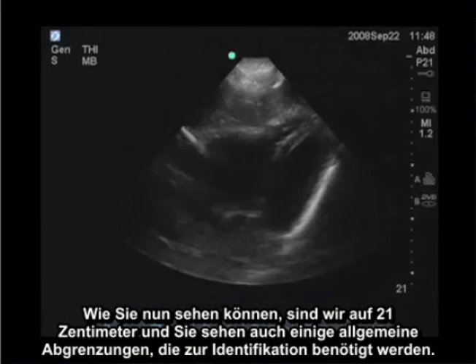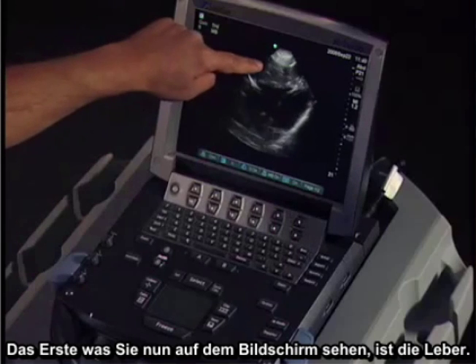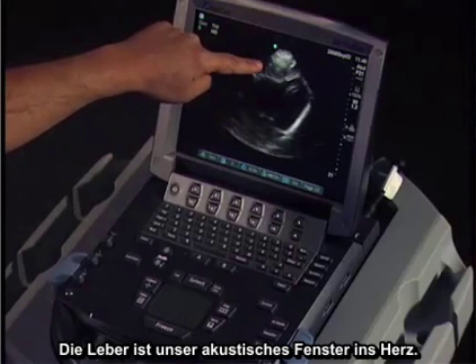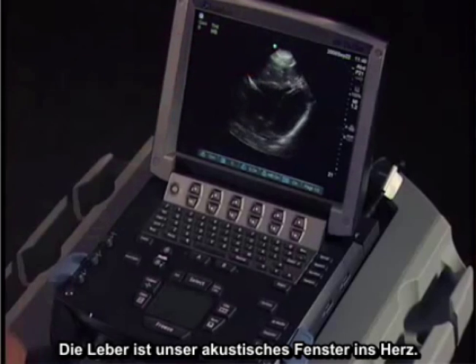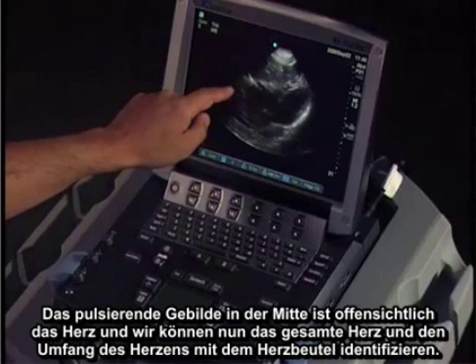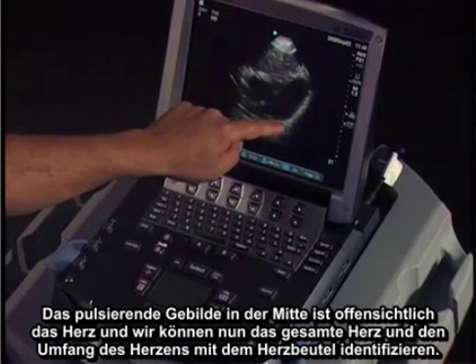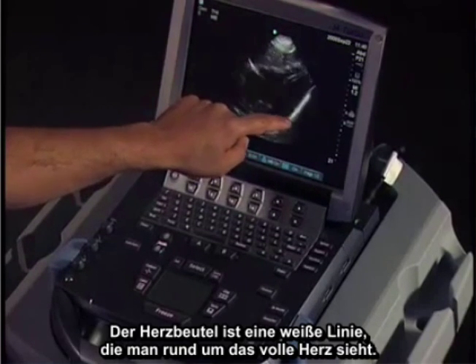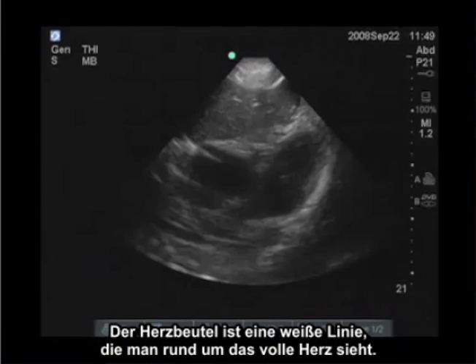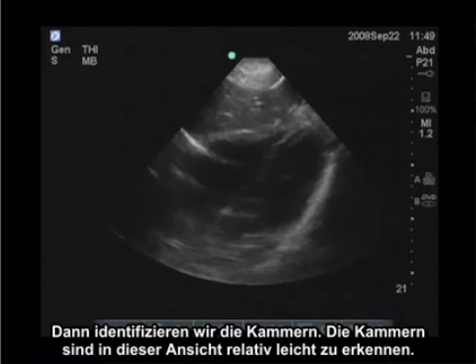Some common landmarks that you need to identify: the first thing you see is the liver at the top of the screen. That liver is our acoustic window into the heart. The beating structure in the center is the heart, and we can identify the entire heart and its perimeter — the pericardium — which appears as a white line surrounding the full heart.